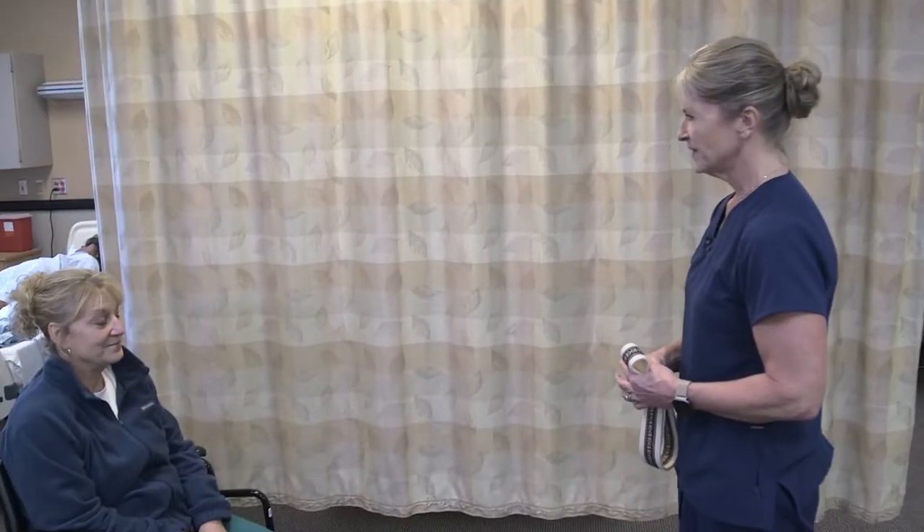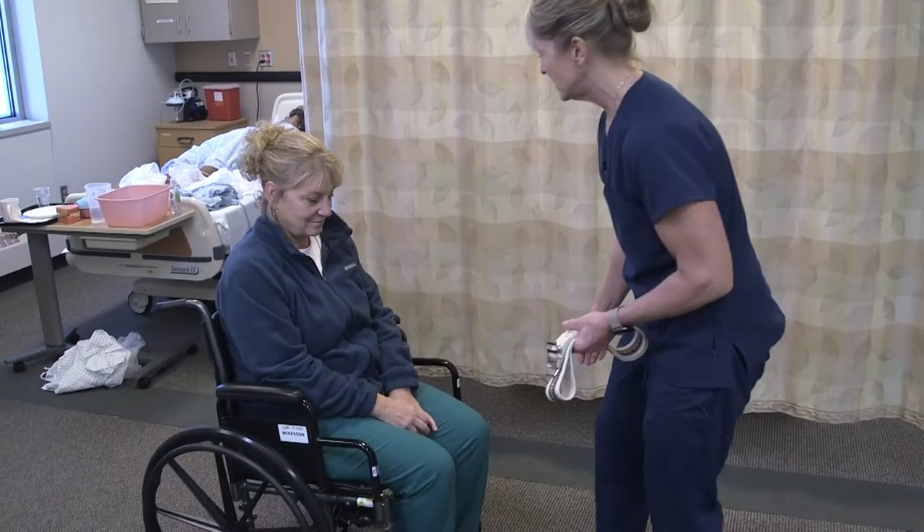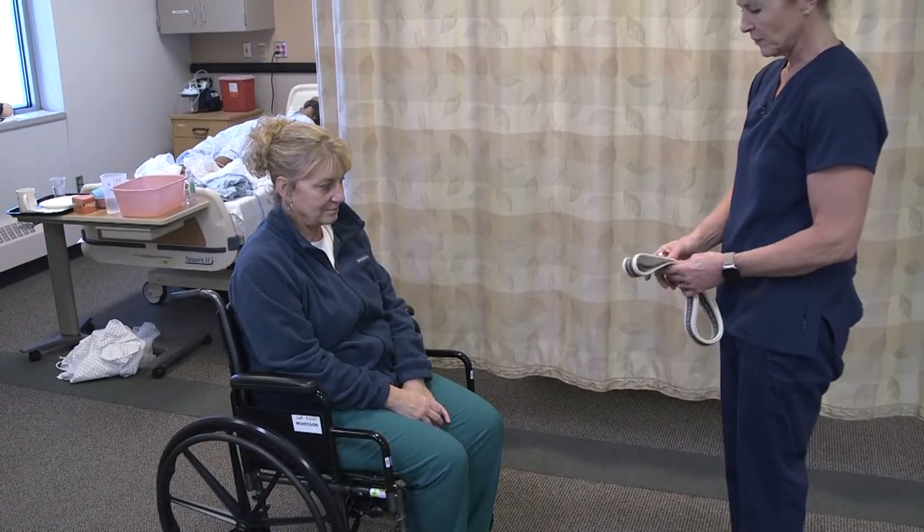Hi Annie, do you want to go for a little bit of a walk? Typically this is happening in the hallway, so we don't need to pull the curtain. I have her brakes on, and we want to check for non-skid footwear.